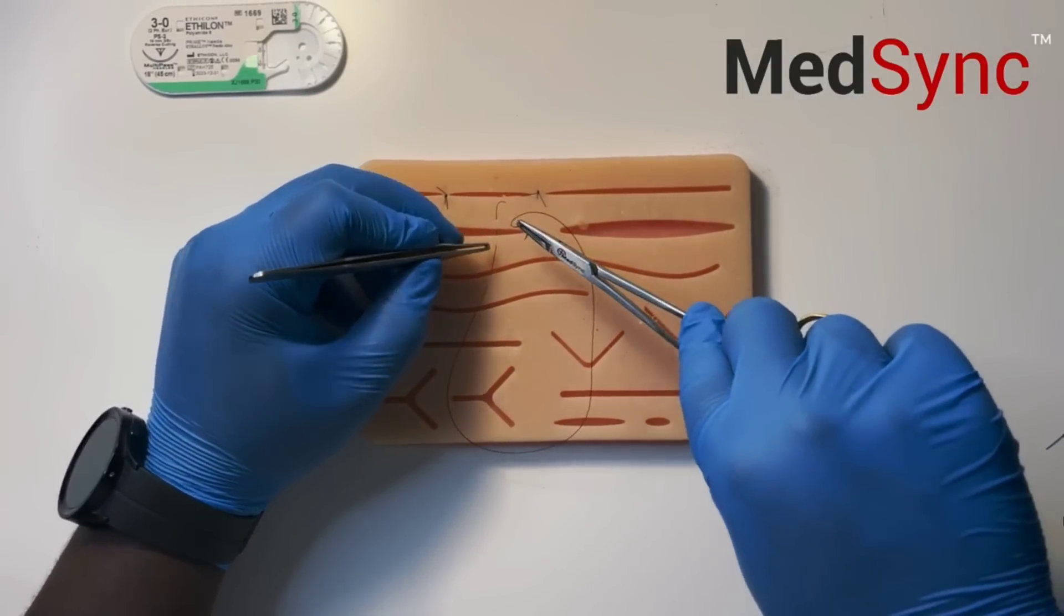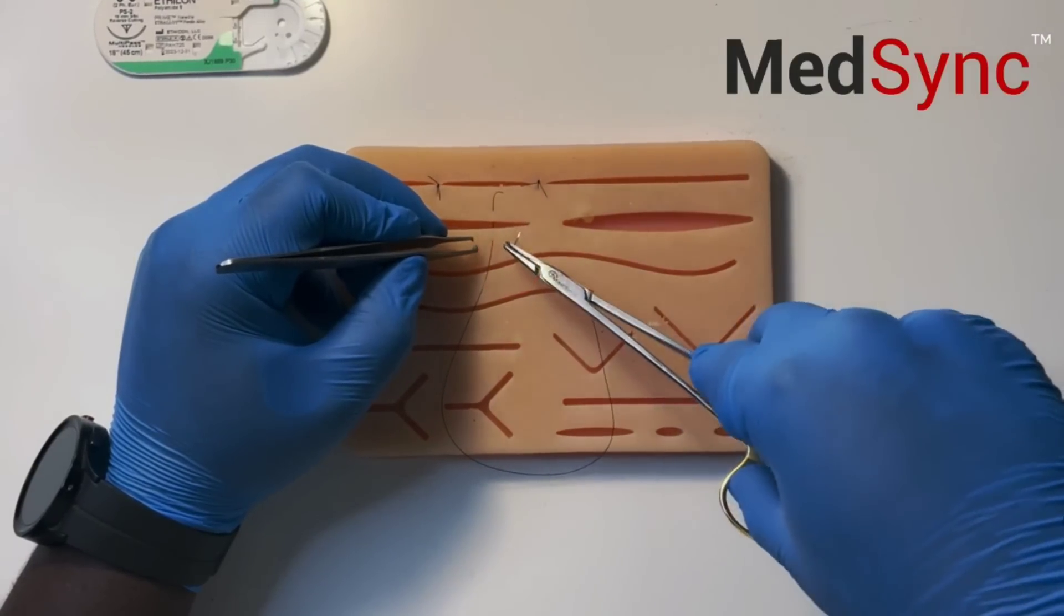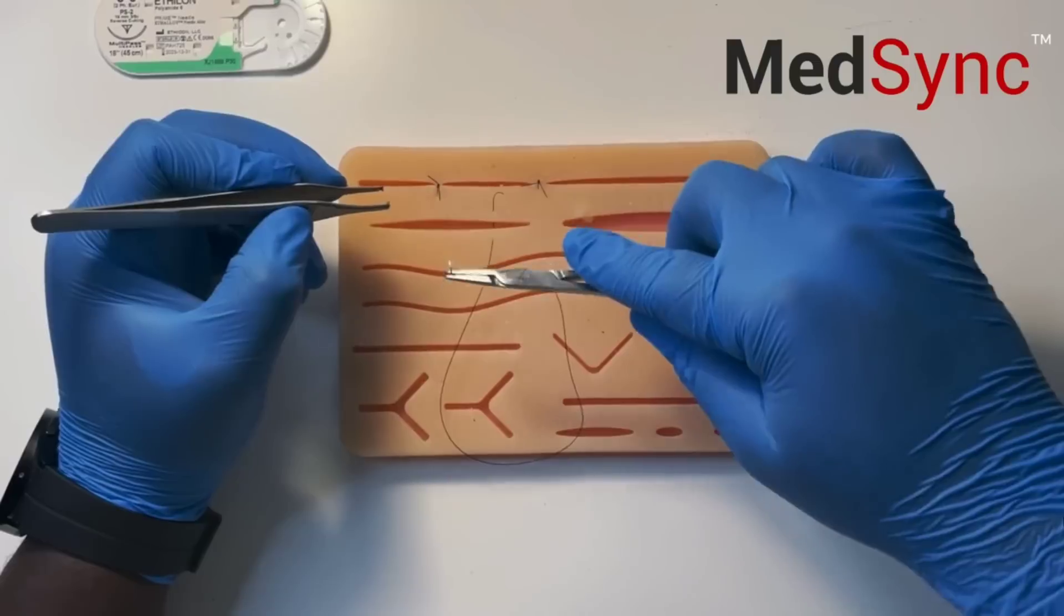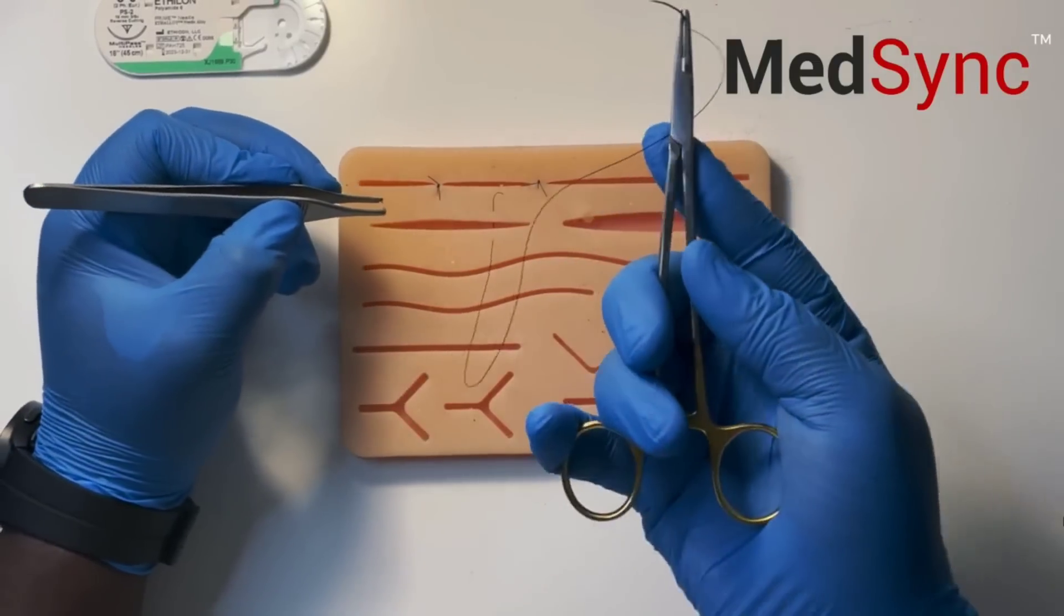Pay close attention to this. I rotate the needle around. I take my fingers out of the needle holder into the palm grip like this.